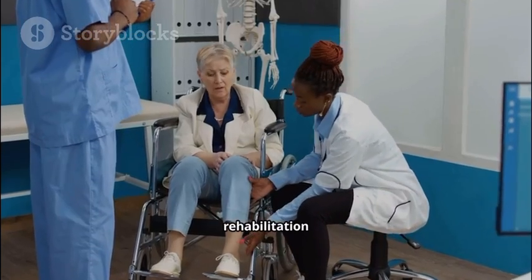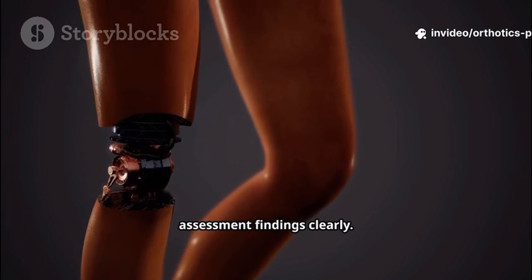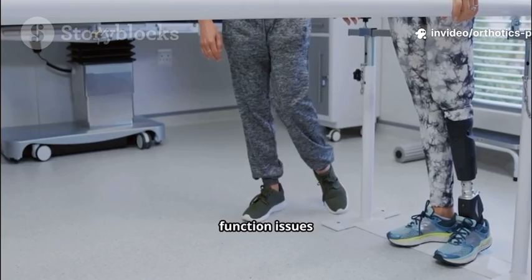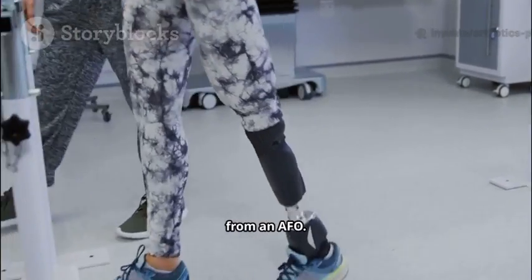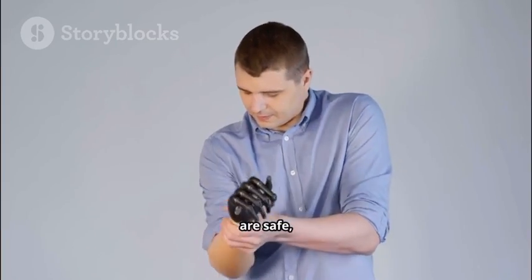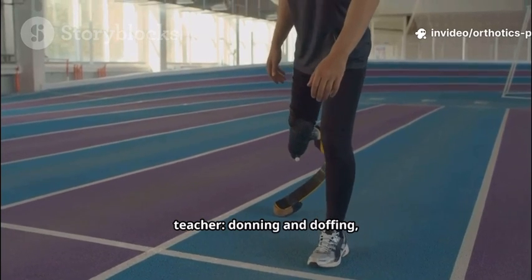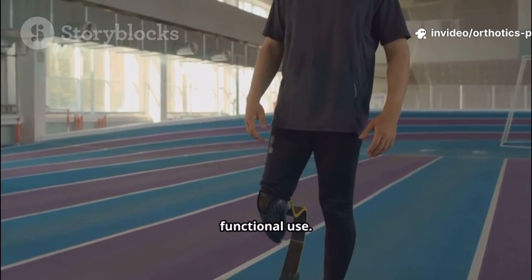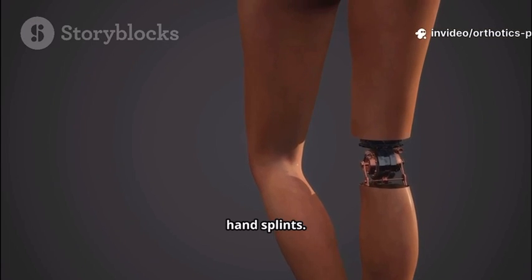You are part of a rehabilitation team. Collaboration is key. Communicate assessment findings clearly. Report fit and function issues immediately, like persistent redness from an AFO. Effective teamwork yields devices that are safe, comfortable, and goal-driven. Be an excellent teacher: donning and doffing, skin and device care, functional use. Train gait for new prosthetic legs and task practice for hand splints.